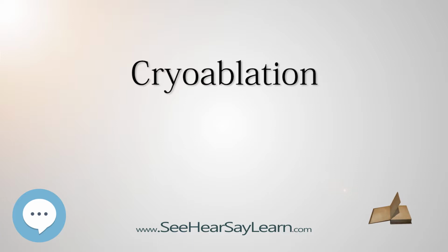With cryoablation, areas of tissue can be mapped by limited, reversible freezing, e.g., to -10 C. If the result is undesirable, the tissue can be remapped without permanent damage.